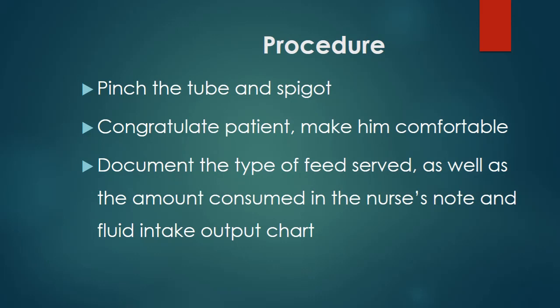Even though mostly our patients are not conscious, after feeding it's still very important that we congratulate them for the cooperation they have given us. You congratulate or thank the relatives that are by you too. Then you document the type of food you have given. So patient was given milkshake, patient was fed with light soup, patient was fed with diluted porridge.